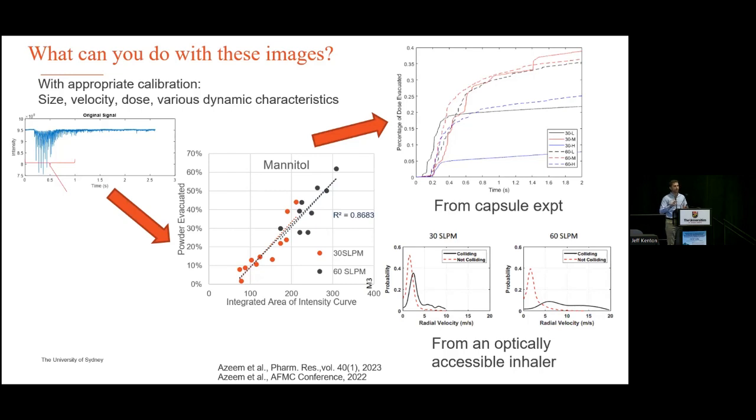And the disclaimer here is that both of those devices had some very similar mechanisms, right? So they both had a sort of dominant swirl effect and sort of tangential inlets. But it would not be very complicated to expand something like that to apply to other DPIs as well. So I guess the other comment I will make here is that data science has come a very, very long way. And we're producing data here in terms of what's happening inside the DPI. There's already a lot more data available and published in the literature. And the conditions are probably ripe now to try and make use of even relatively basic modern machine learning methods to try and make certain predictions. But you know, we've done that here.